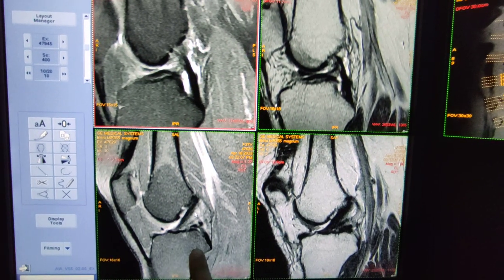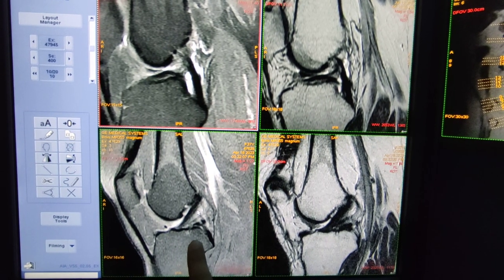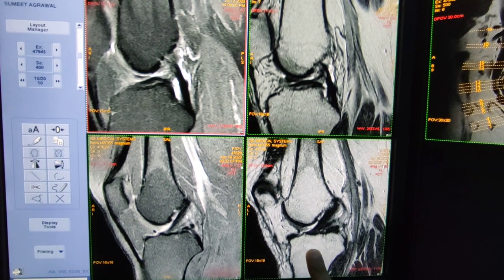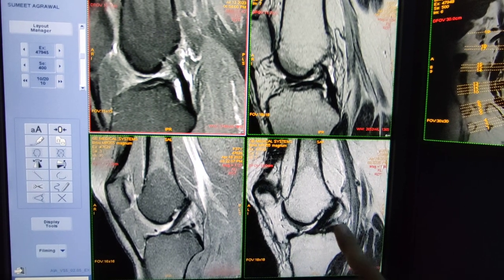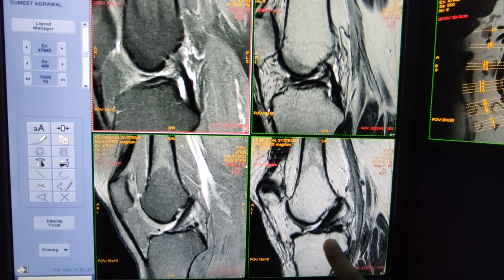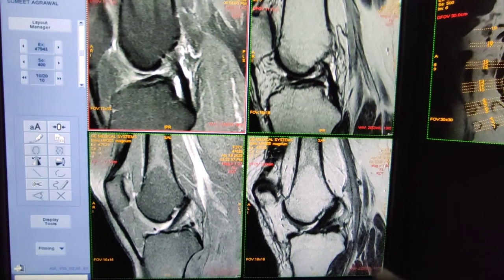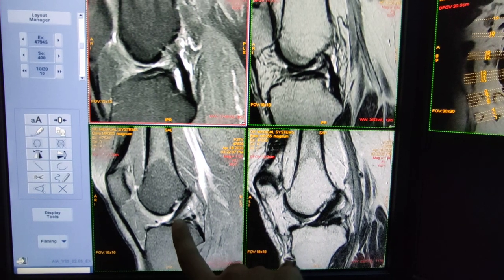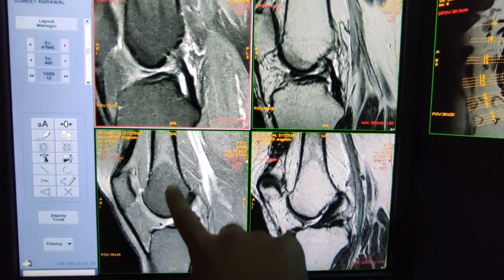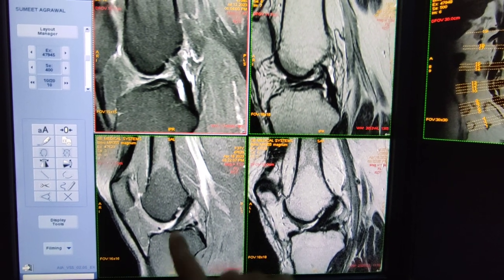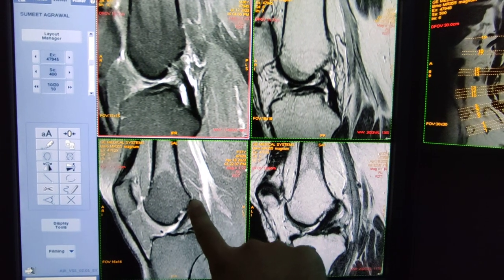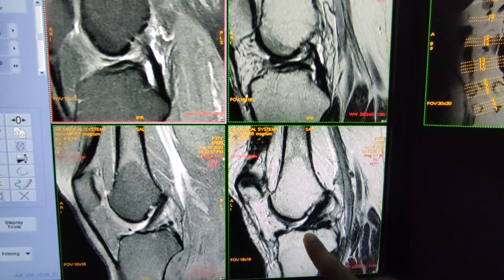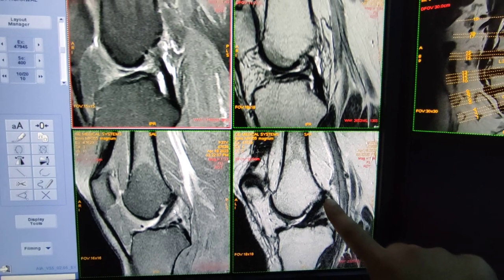This is the fat sat PD sequence. This black sequence is known as fat sat PD or STIR — someone takes STIR sequence also. This is a very important sequence: this is the T2 weighted sequence. We always take thin sections of the ACL to diagnose how many fibers have been involved. This upper bone is called the femur and this lower bone is called the tibia. This one is the tibial attachment and this one is the femoral attachment.